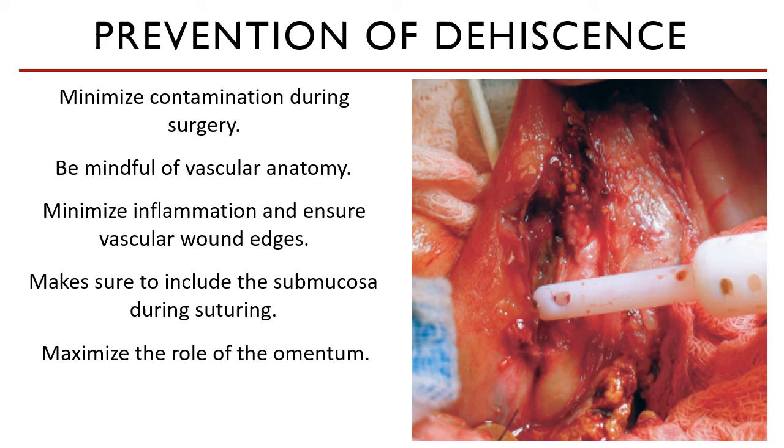One important point is no to catgut. Alright? Chromic gut, catgut, what else? Surgical gut is sometimes the label for that. Do not use that suture because the primary mechanism of dissolution of catgut is inflammation. Right? So when inflammation happens and we expect it to happen, this will actually cause your suture to dissolve. We do not want that.